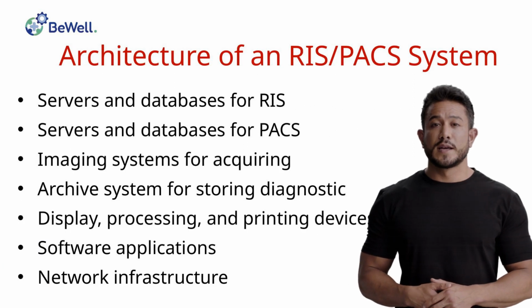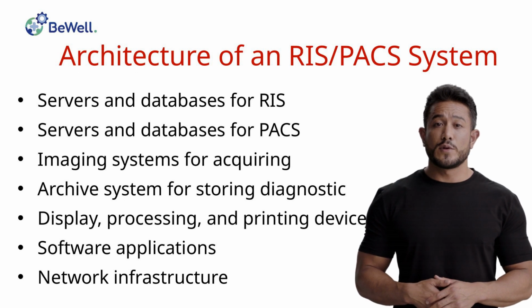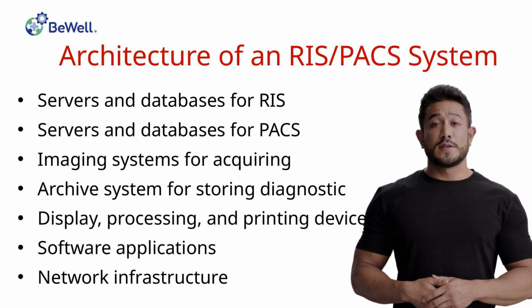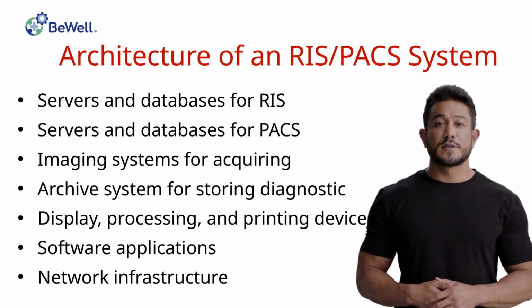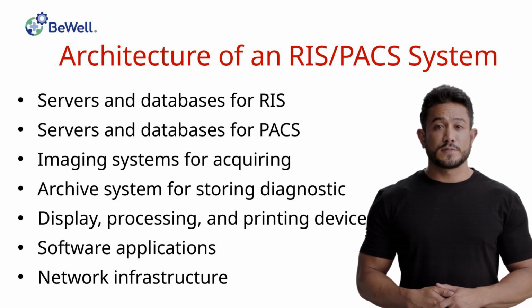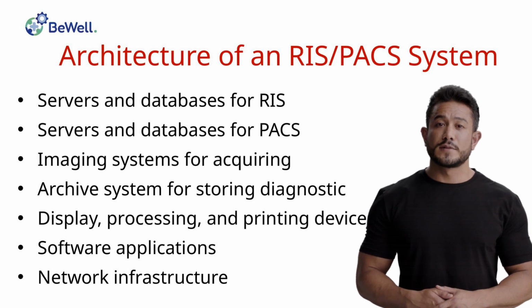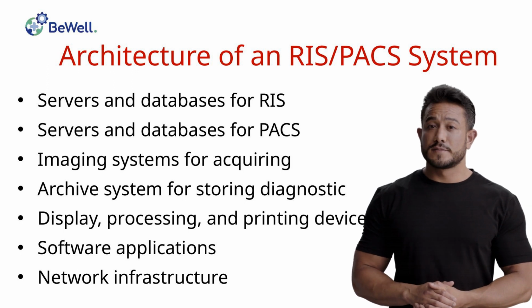The hardware architecture needs to be custom designed for each context, as it may depend on the number of hospitals, wards involved, their workload, and the backup policies required to maintain service continuity. To achieve typical functions, our RIS PACS system requires various hardware HW and software SW components, which can be classified as follows. Application servers and databases for RIS management. Application servers and databases for PACS management.